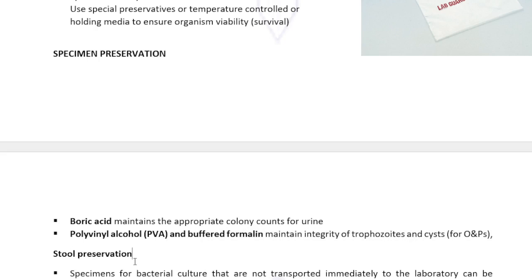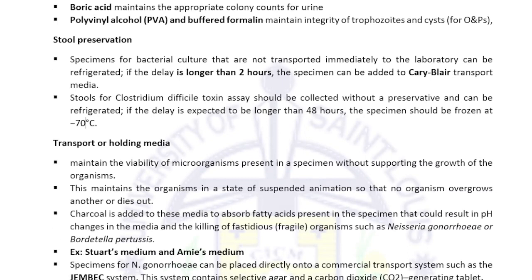Okay, stool preservation, if that is not transported within 2 hours, as I said, it can be refrigerated. If the delay is longer than 2 hours, Cary Blair transport media should be utilized. Okay? Stools for Clostridium difficile toxin assay should be collected without preservative and can be refrigerated. But if the delay is more than 48 hours, why would it even reach 2 days? For those sent for confirmatory testing, it should be frozen at negative 70 degrees. But usually, this is not done because it's hard to find a refrigerator that can provide negative 70 degrees. Right? Our freezers usually don't reach that.